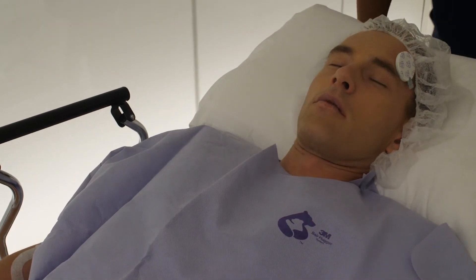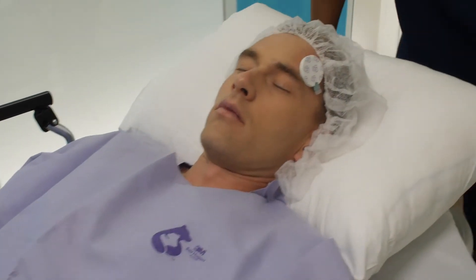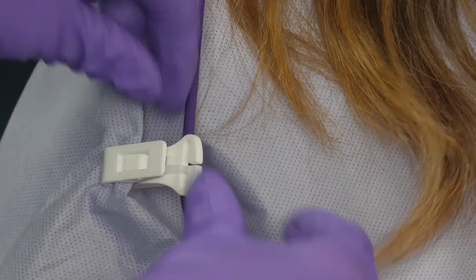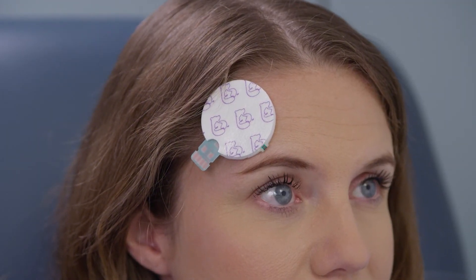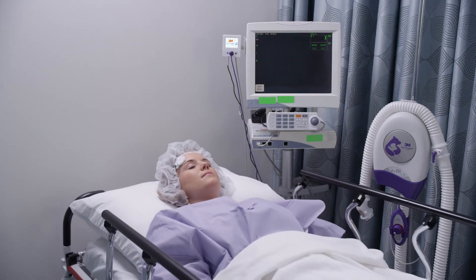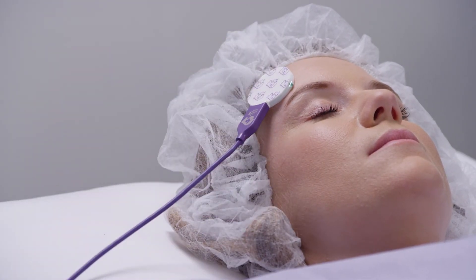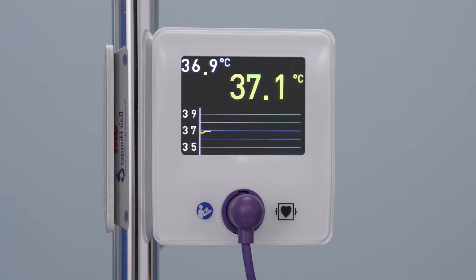When the patient is ready to be moved, for example from pre-op to the OR or from the patient unit to another destination, disconnect the sensor from the sensor cable and then disconnect the cord clip. The sensor should be left on the patient and reconnected to another Bearhugger Temperature Monitoring Control Unit. When the patient has been transferred, carefully reconnect the sensor to the sensor cable and control unit, and attach the cord clip if desired. When the sensor is reconnected, the system will re-equilibrate. The patient's last recorded temperature will be captured in the upper left-hand corner of the screen.